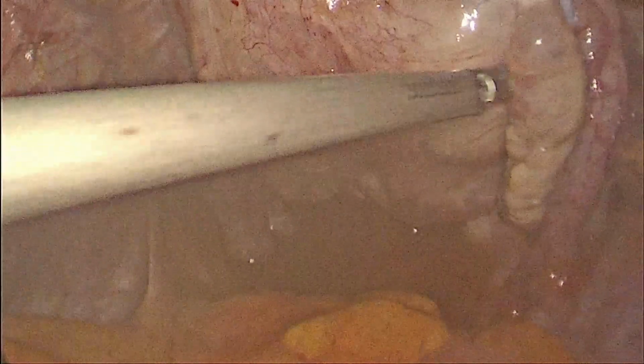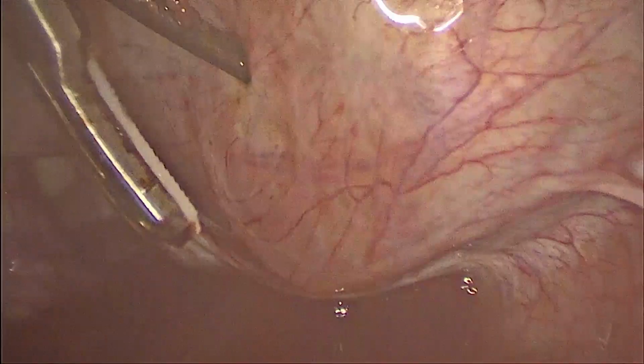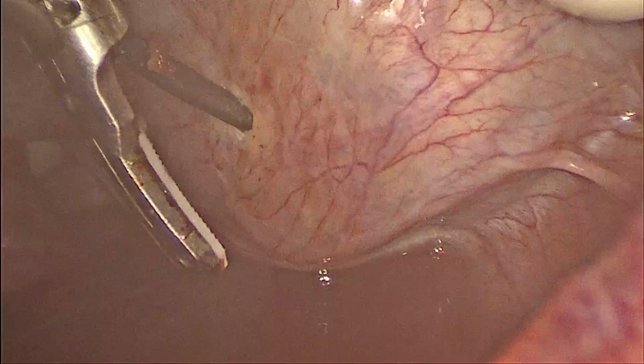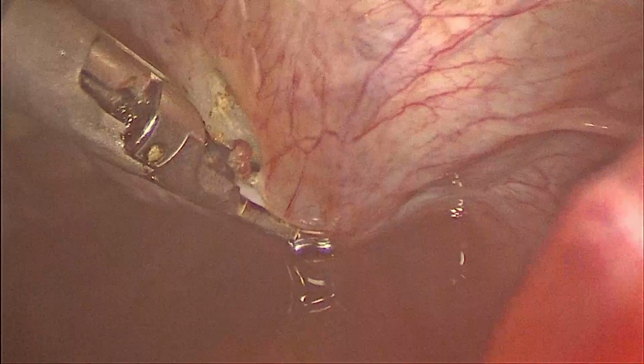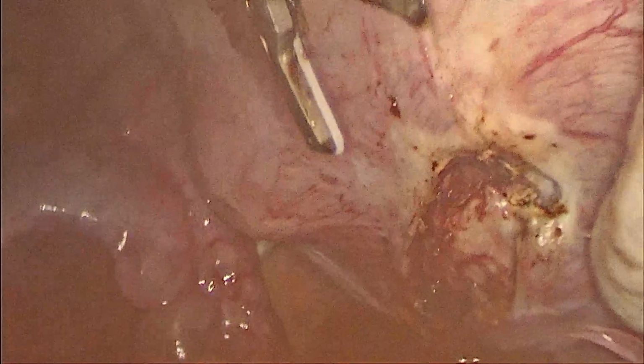Now we have started the myomectomy, taking a vertical incision on the lowest fibroid possible. Harmonic scalpel was useful in making an incision with less smoke and good visibility.